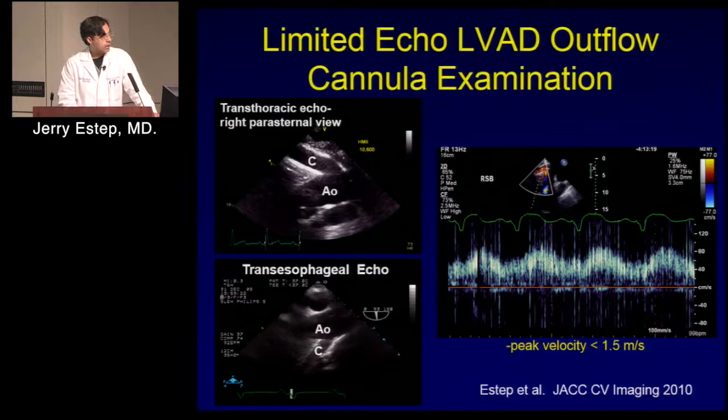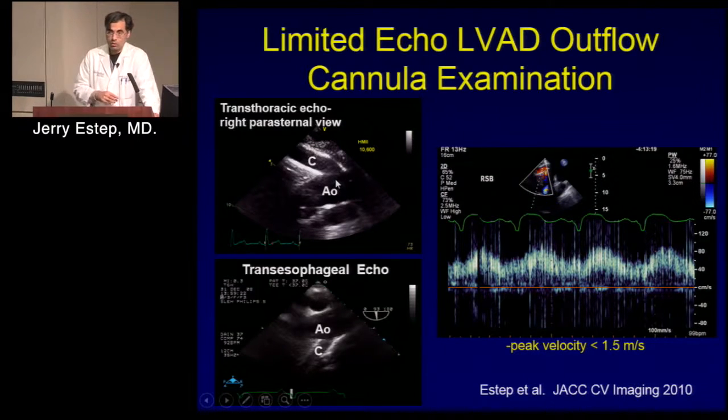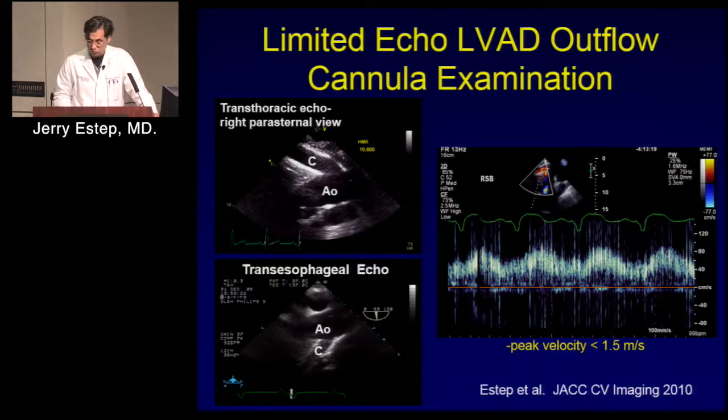And then the outflow cannula can be imaged by the transthoracic echo. And there are some instances where we're worried about kinking and the lack of a Doppler signal or obstruction, and you can see a change. But these outflow cannula velocities mirror what we see from the inflow cannula velocities. And so you don't need TEE. You can certainly appreciate it by TEE. So the tech should be imaging all patients along the right parasternal border to understand outflow cannula velocities.